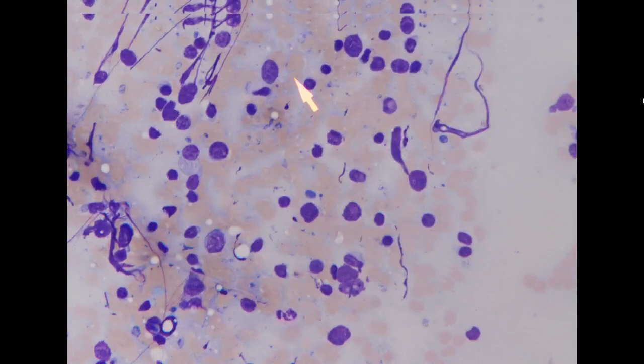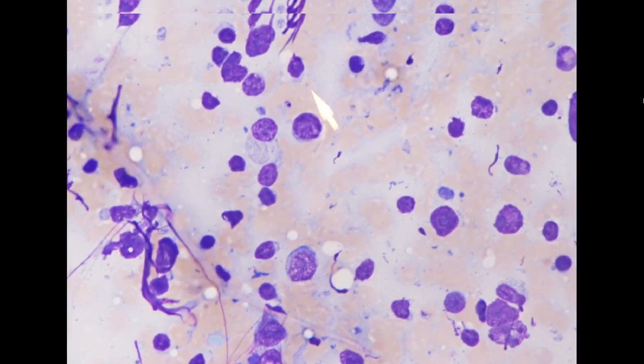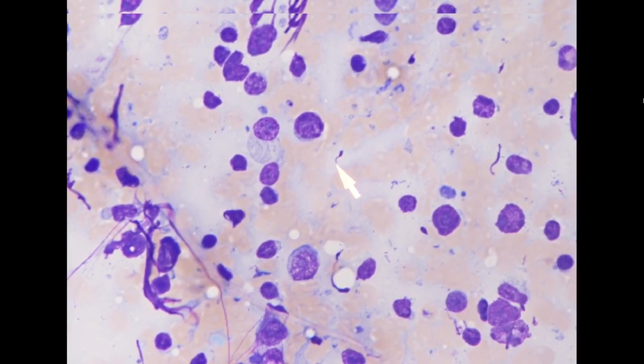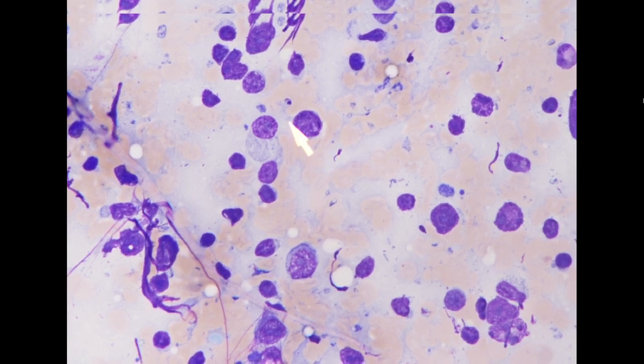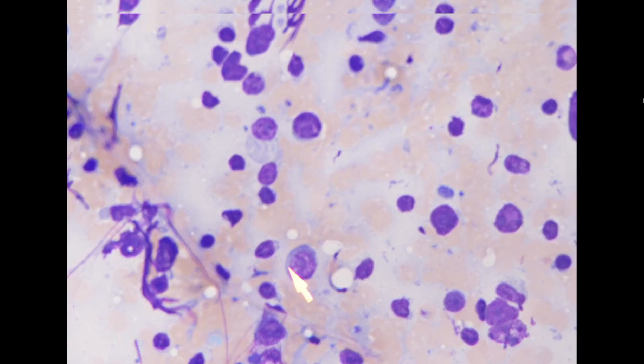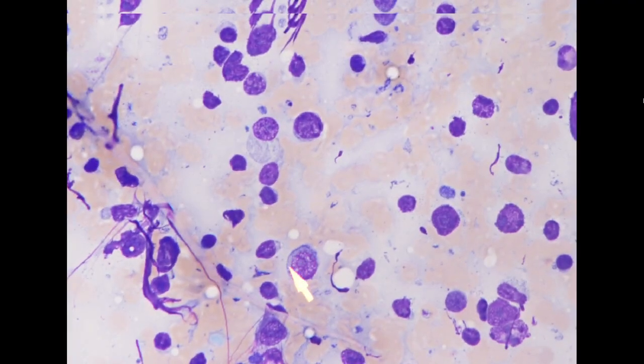So whenever we want to confirm if the cell origin is of lymphocytic lineage, we go to the Diff-Quik stain, the Giemsa stain, and we want to identify a basophilic granular ring around these atypical cells. We call this basophilic rimming.